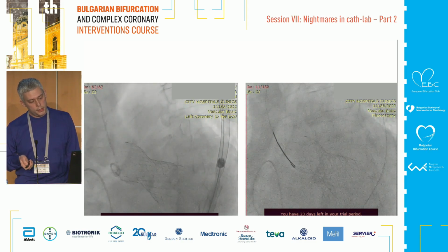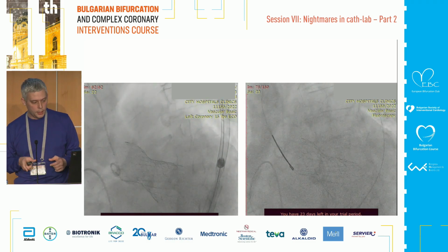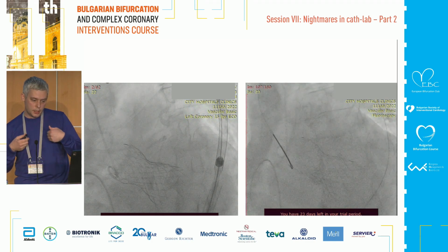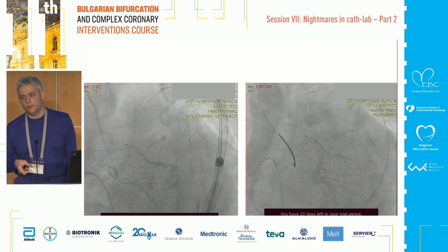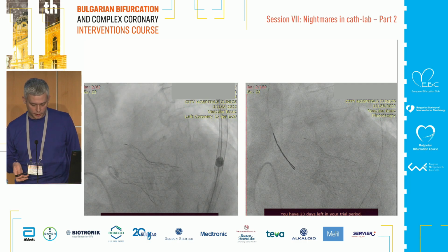The problem here is that the initial part of the nitinol frame covered with pericardium is completely in the left ventricle, and unfortunately every attempt to post-dilate such a valve or to wait for the nitinol frame to adapt is nonsense.